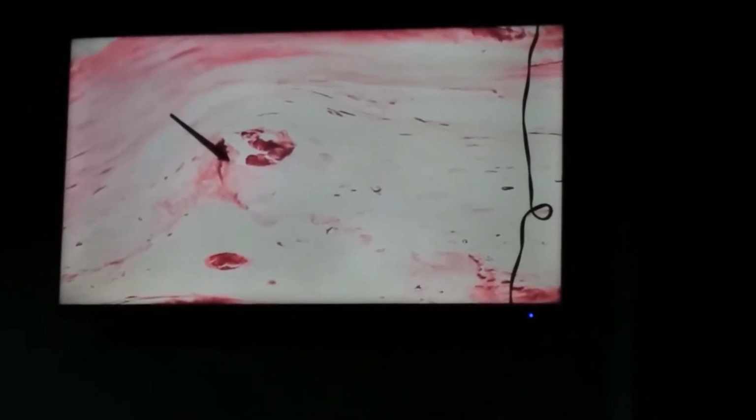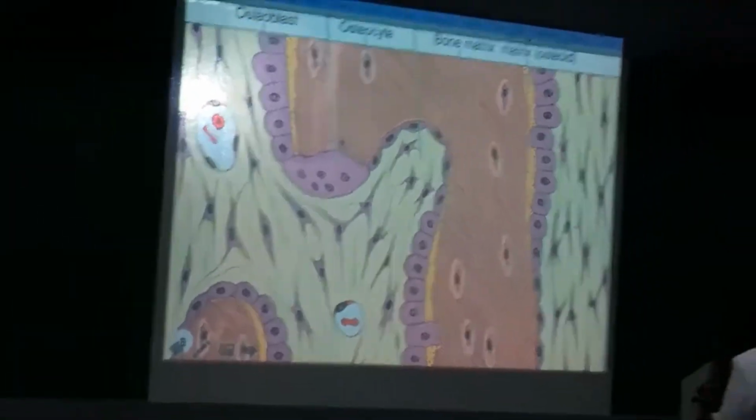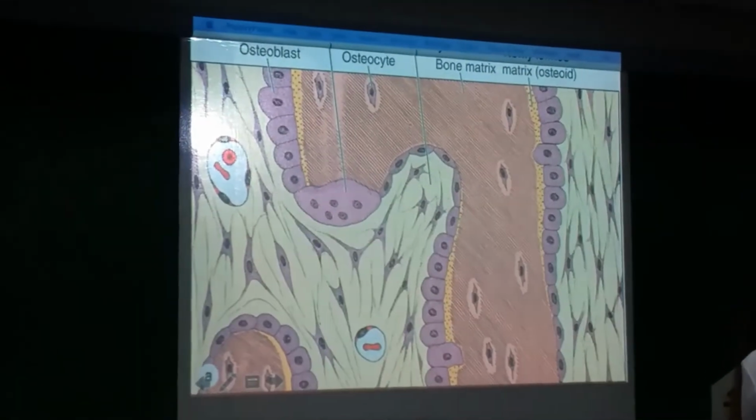Multinucleated because of the number of nuclei present in this cell. When you say multi, they can be continuous. Look at the TV screen. They can be here, they can be in the bone matrix. Basically, they are considered as a multinucleated giant cell. They can be in the matrix, or in the periphery, together with the osteoblasts.